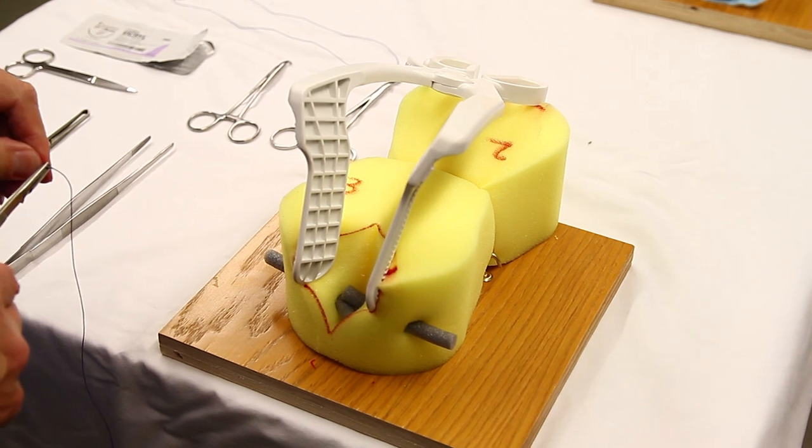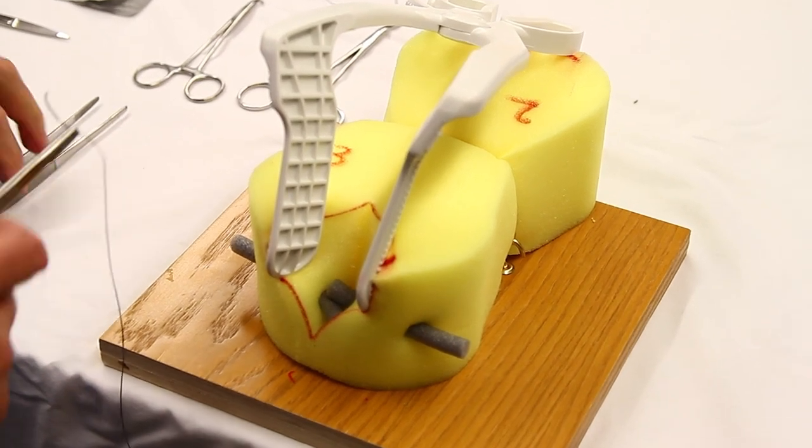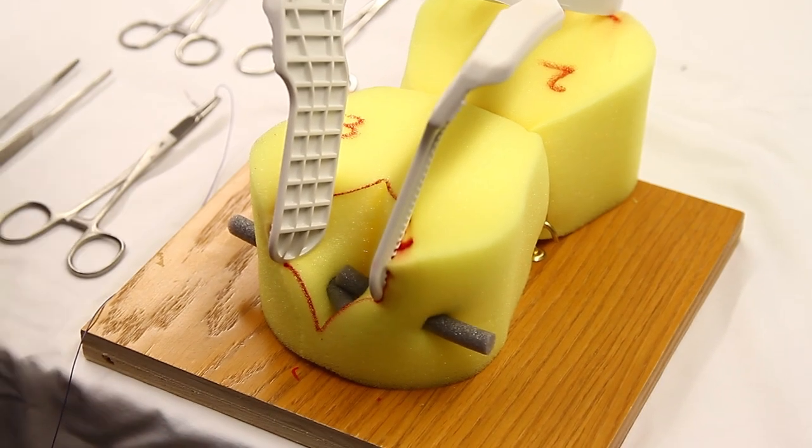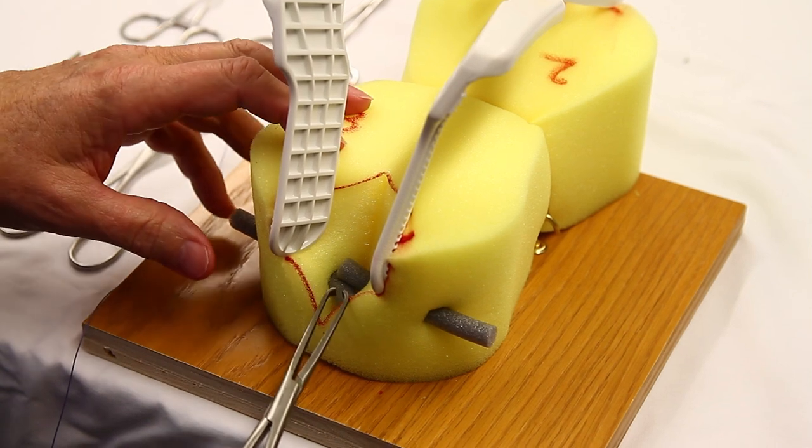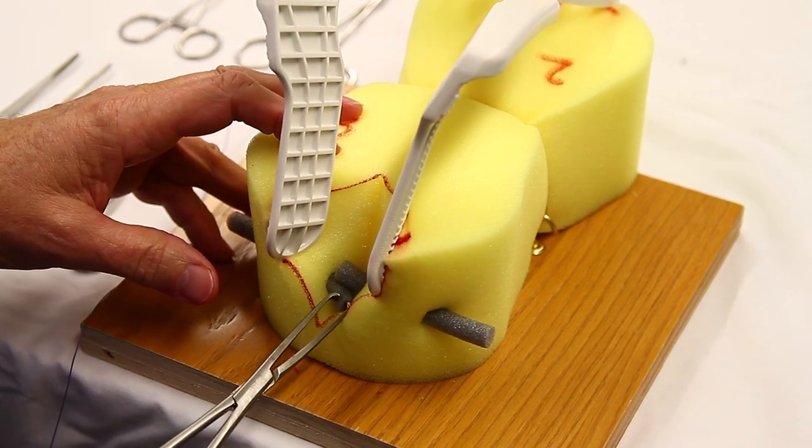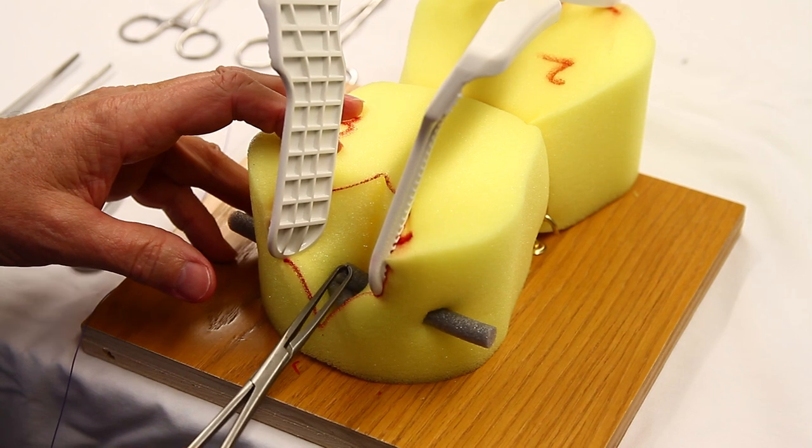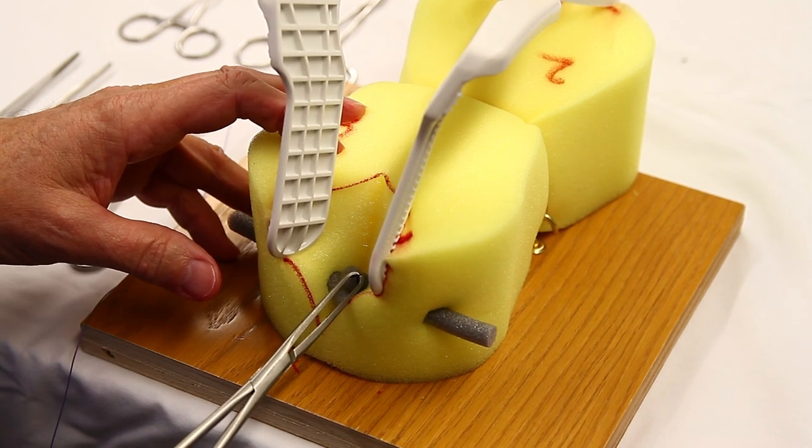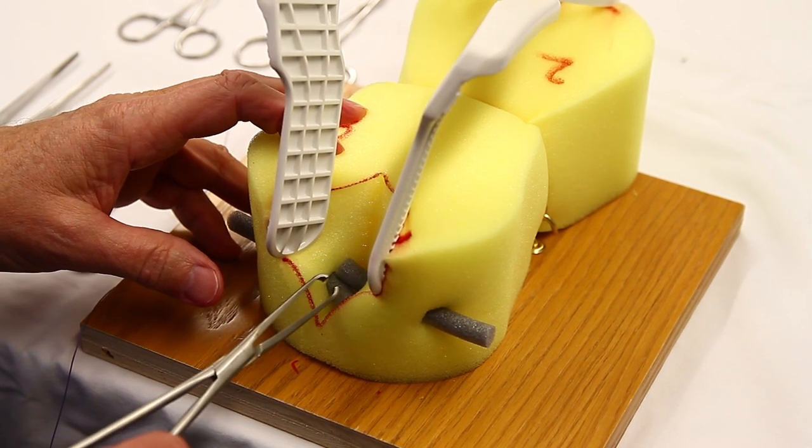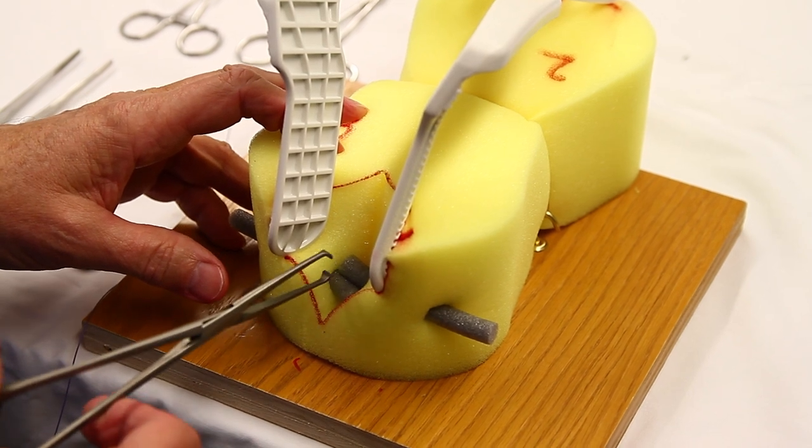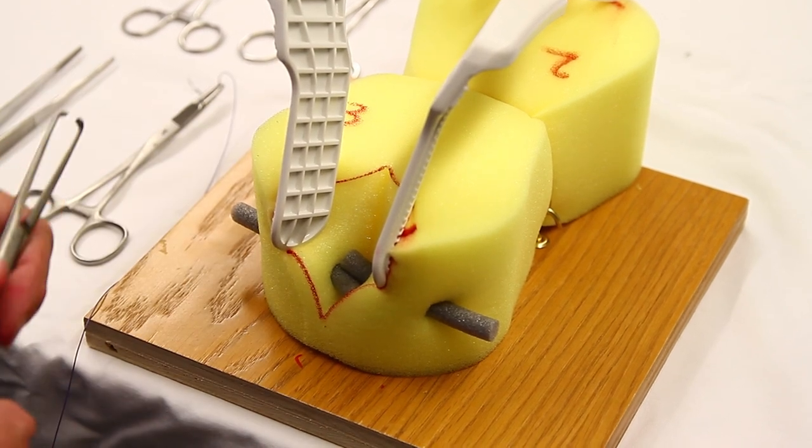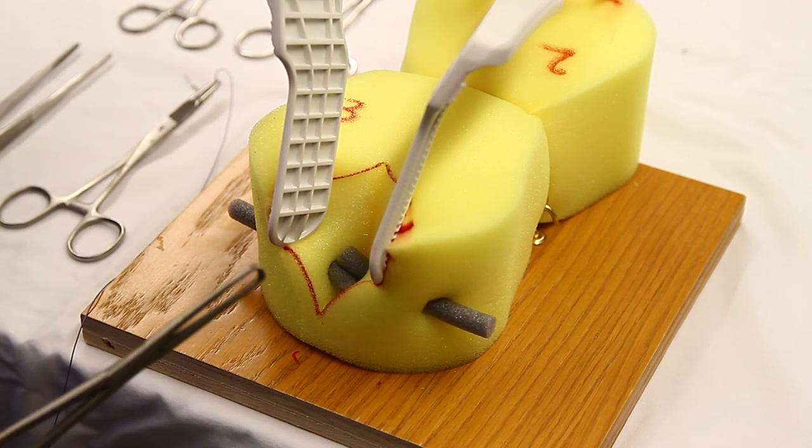We're going to demonstrate the side-to-side repair of the rectal sphincter. Physicians in the past have used the four-point repair like the hands of a clock, 12, 3, 6, and 9. The overlapping repair side-to-side is more durable and favored by rectal surgeons and will be the method I propose here.